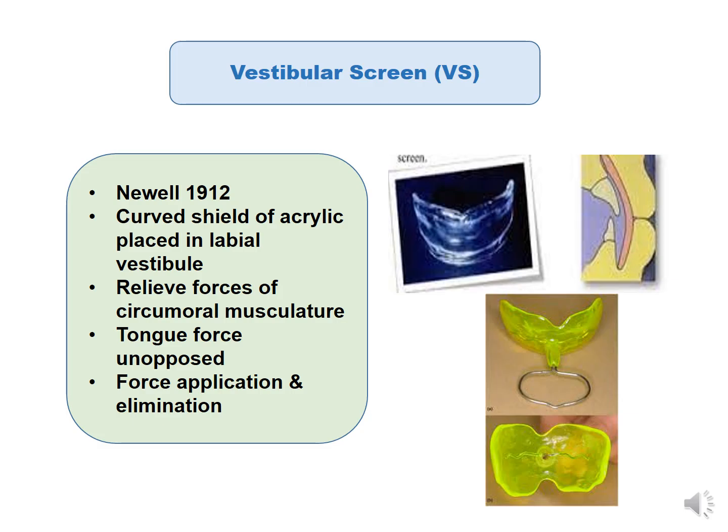Now, the vestibular screen was introduced by Newell in 1912. It's a curved shield of acrylic placed in the labial vestibule. It relieves the forces of the circumoral musculature, which causes the tongue force to be unopposed.